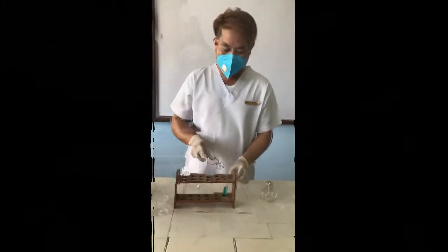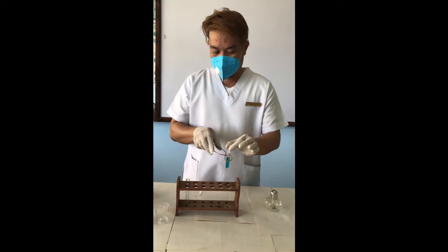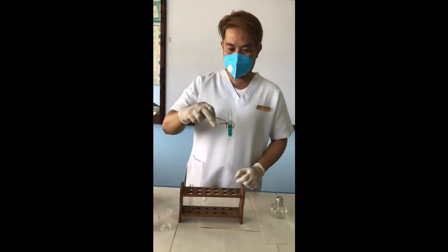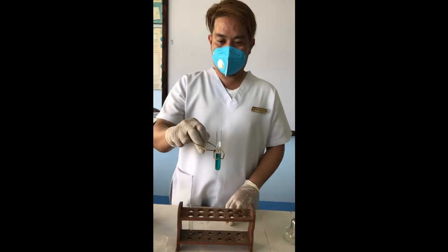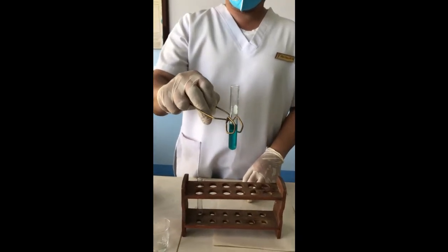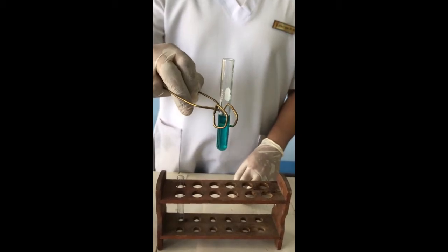Interpret the results and record. After one minute, observe the results of the urine. If it is blue, that means it is absent. If it is green, it contains 0.5% sugar.